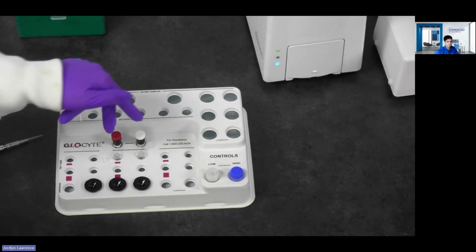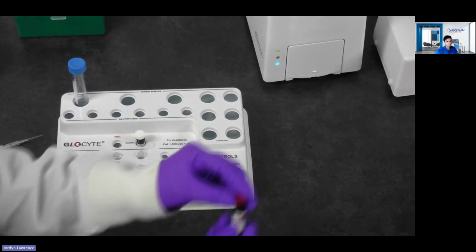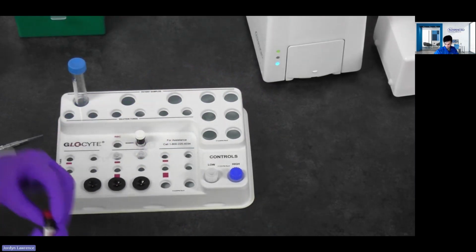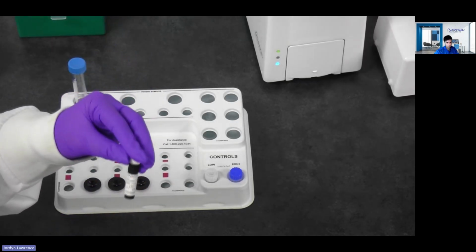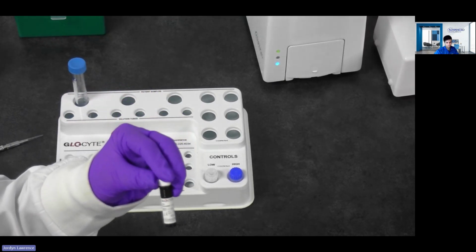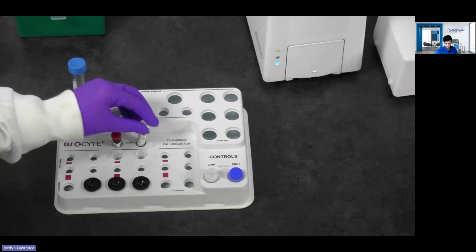Going over to the other reagents that we have here, we have the red blood cell reagent. Not sure if you can see that. This is an antibody stain, so it stains onto the red blood cell. This one over here is the white blood cell. This one is the TNC reagent. This one's actually really unique. It lyses the cell to get into the nucleus and stain the nucleus of the white blood cell.